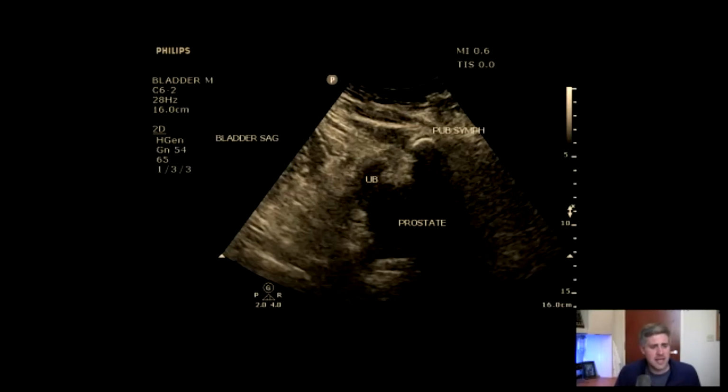So here you can see in that sagittal oriented image, the pubic symphysis. Remember, see that bright white rim of the pubic bone there in that dark shadow, right? That's the landmark that we're looking for. If you go immediately above that, right, you can see the urinary bladder, which is very much decompressed in this situation, right? Again, UB represents the bladder. You can see that the wall of the bladder decompressed, so there's not much in there. And then the prostate just deep to that, kind of where we'd expect it to be, right? Remember, the inferior posterior aspect of the bladder is kind of where the urethral outlet is, and it's going to go through that prostate as it goes down south, coming out to the external urethra, right? And so that's an example of the prostate, right?